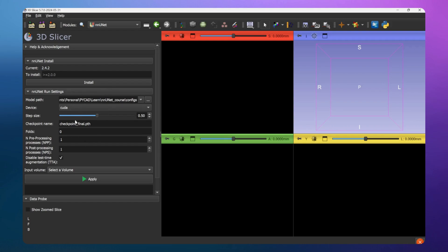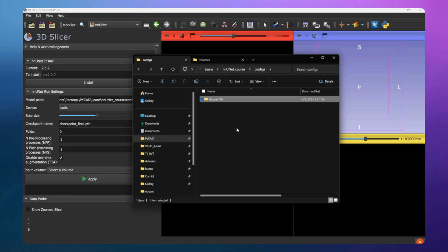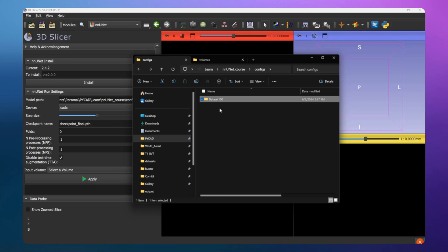After that, go to Settings and configure some things. But first, let me show you the folder structure you need to respect. There is nothing new - it's the same structure used when training or running inference with NNUnet. You need something like Dataset100; the name doesn't matter but you need the word 'Dataset' followed by an integer index.